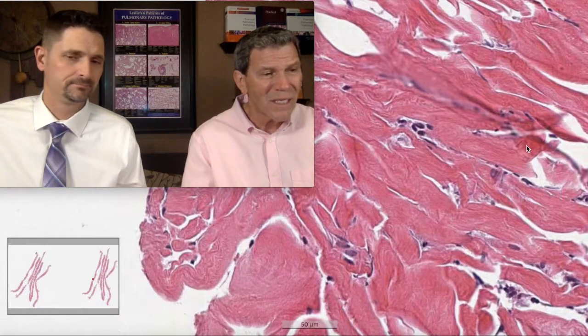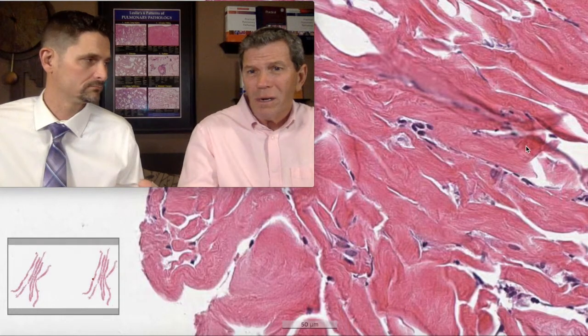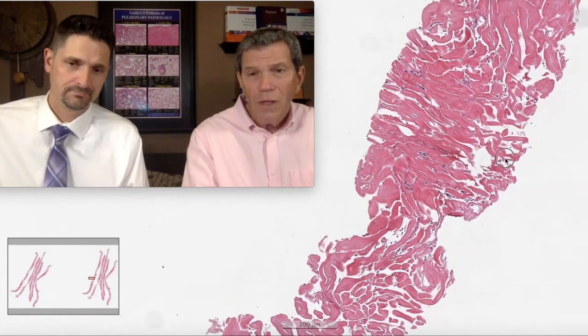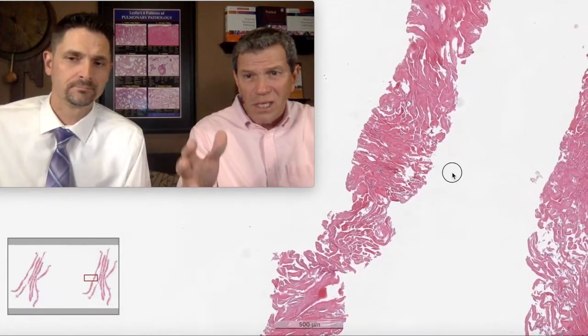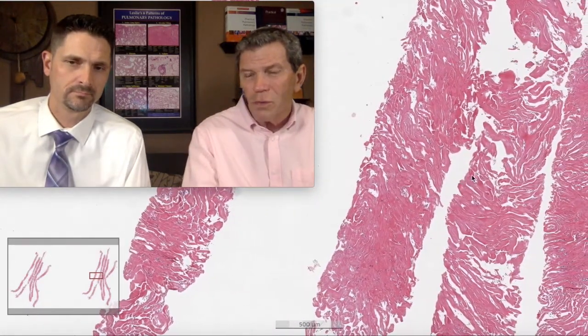So you've got to kind of say, is this a sampling problem? 13 centimeters, we're looking at what, less than a centimeter? Probably half a centimeter of actual tissue. True, with all those cores. So maybe there are other areas of this tumor that are completely different. So what can you do in this situation, Max?